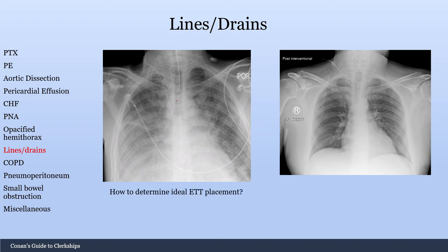How do you determine ideal endotracheal tube placement? It should be within 5 centimeters of the carina — 5 plus or minus 2 centimeters. You can see the carina branching here, and you measure the endotracheal tube's distance. If it's within 5 centimeters of the carina, it's a well-placed endotracheal tube.